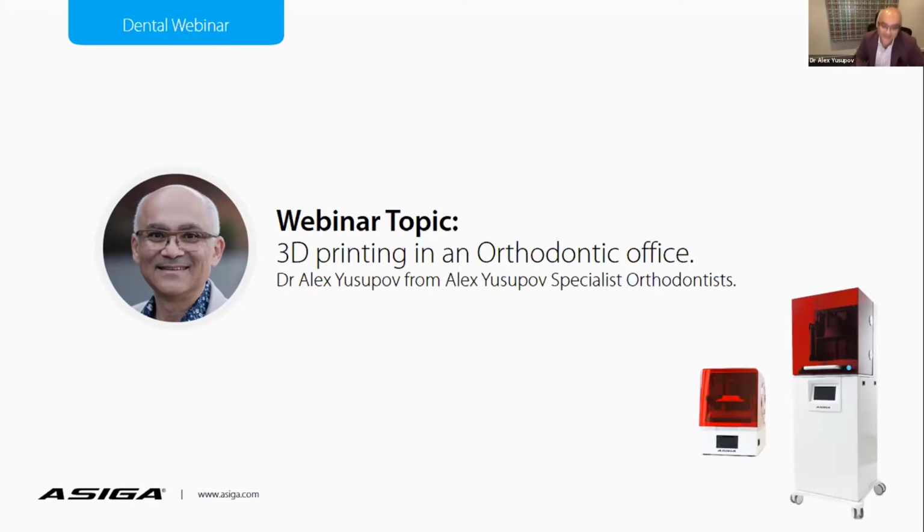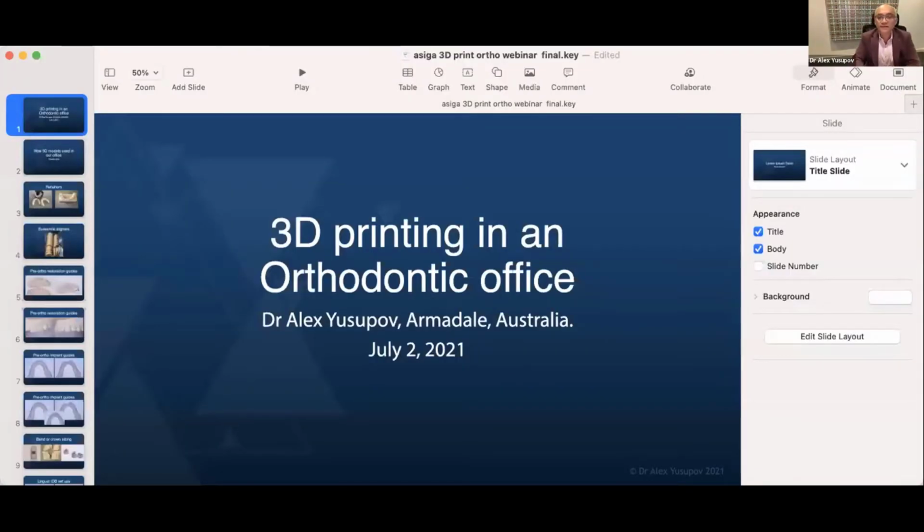Thank you, Graham. It's a pleasure to be here, and thanks for inviting me. Hi, everybody. Thank you for joining. And I'm extremely happy to be here today and talking about something that I'm very passionate about.